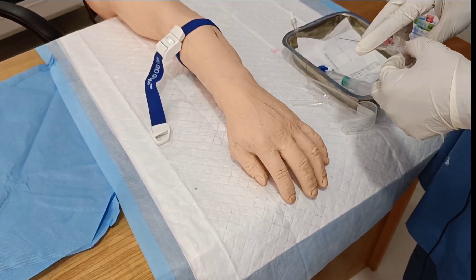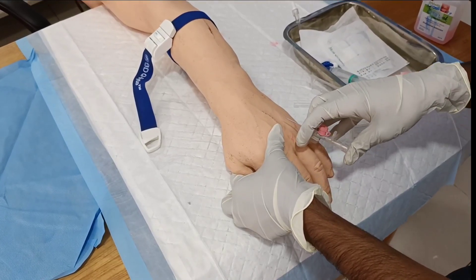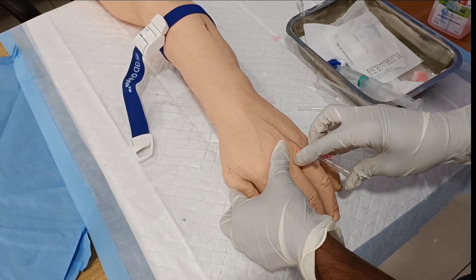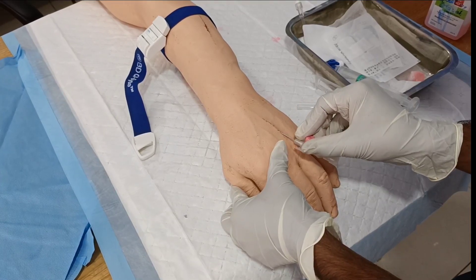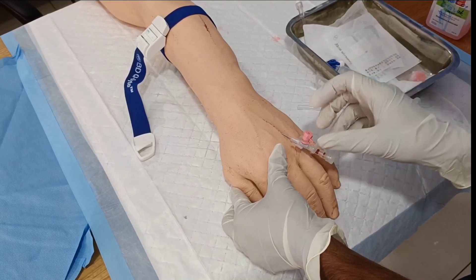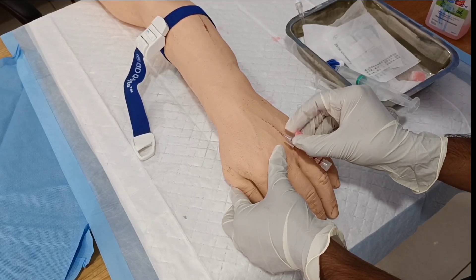Perform the procedure by applying gentle traction — just extending the skin. Insert the IV cannula at an angle of 10 to 30 degrees into the vein. Once in the vein, if blood enters the flashback chamber, slowly withdraw the needle and gently push the catheter further into the vein.